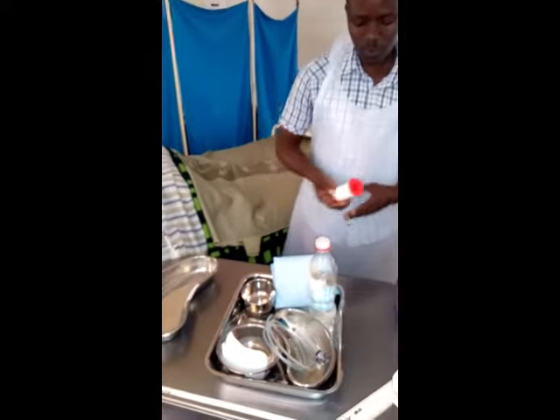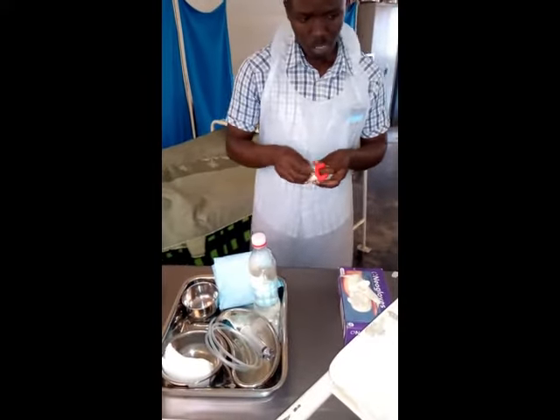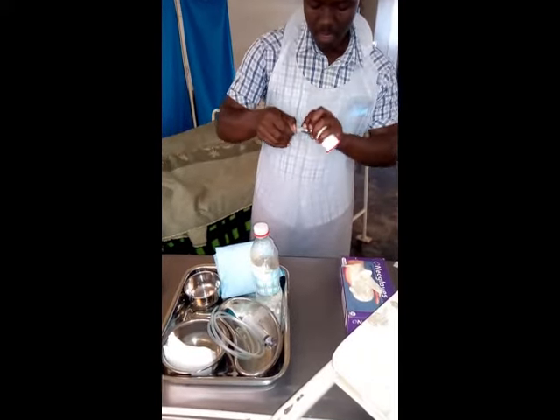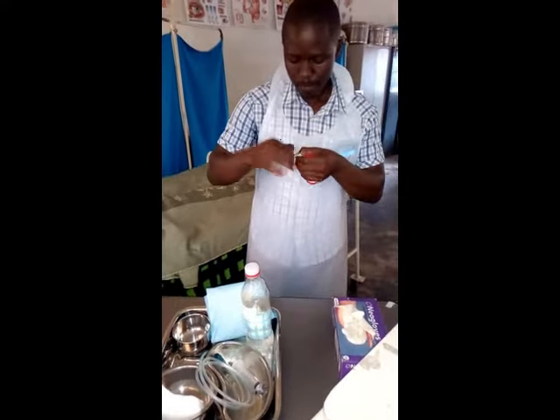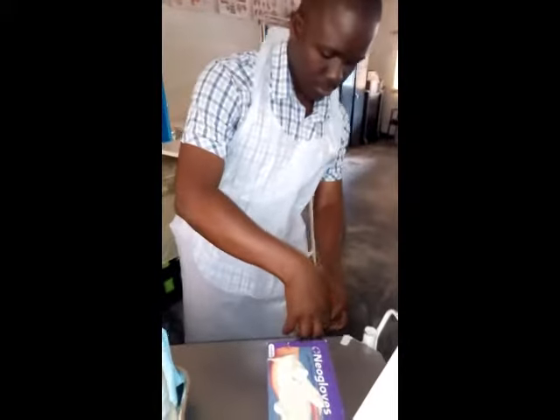strapping in advance, because we need a tape for marking. So we need to prepare strapping. So you can go that way, meaning this one will work as a tape. Okay. So we put it there. So my tape.